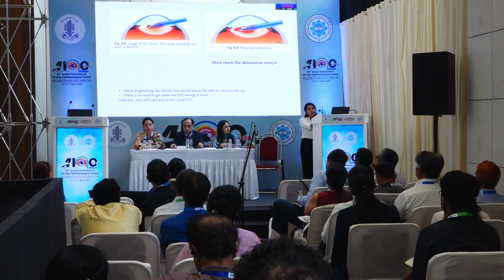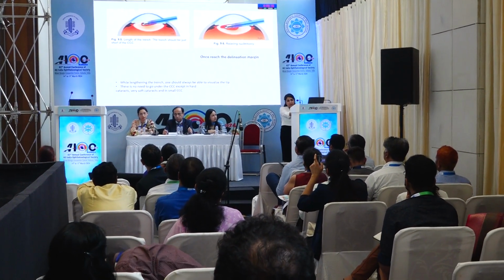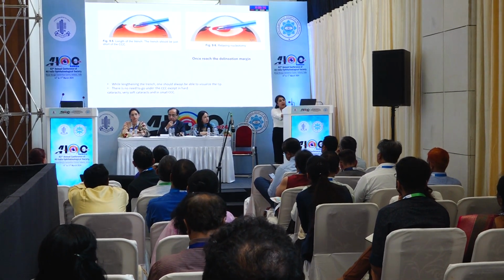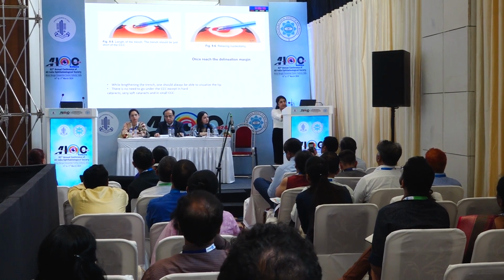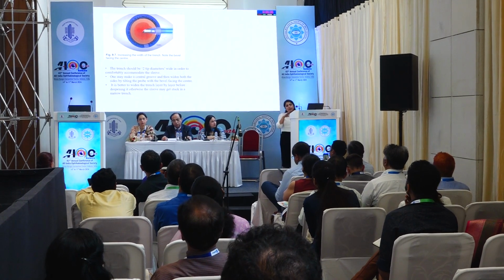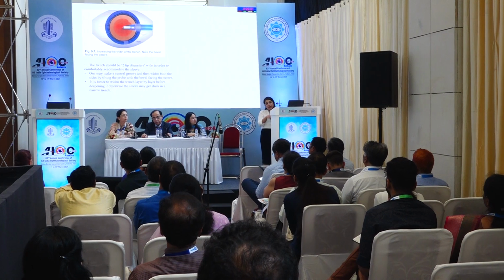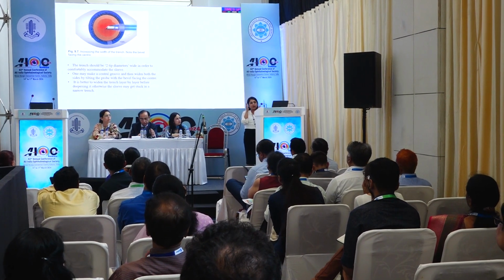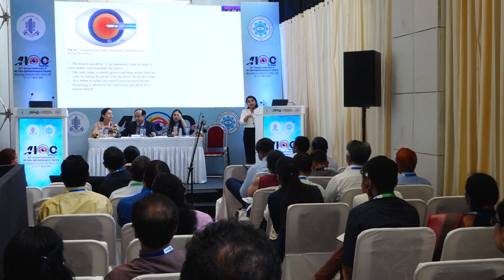Now, the length of the trench ideally should be within the capsulorhexis margin. In case of really hard cataracts or very soft cataracts, you can go under the capsulorhexis to the delineation margin, which is called relaxing nucleotomy. And when you want to widen it, like Dr. Lal said, we feel a bit unsafe if we are not able to see the tip. So it is better to keep the bevel up and then just widen it like this. On two sides, it should ideally be 2 tip diameters so that the sleeve doesn't get stuck in the trench.